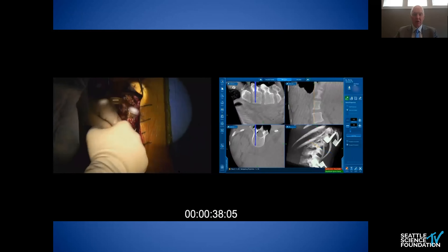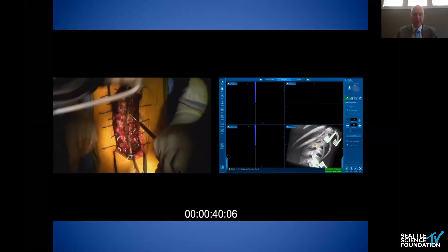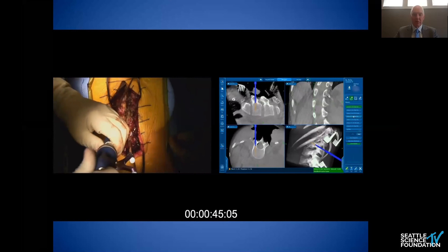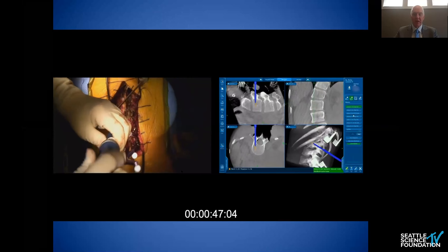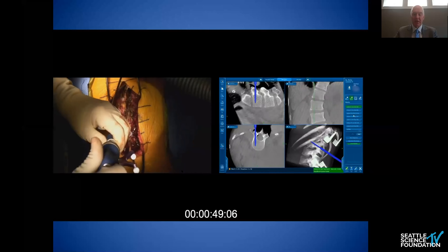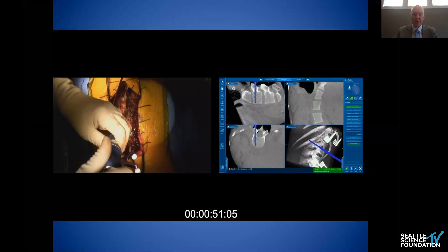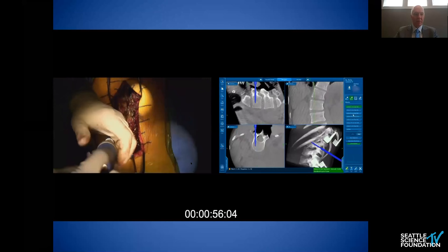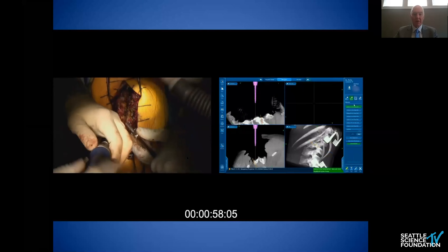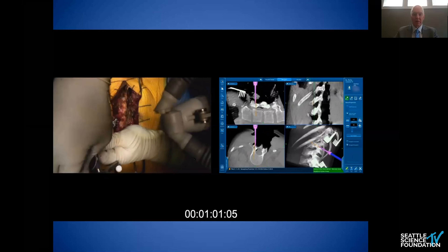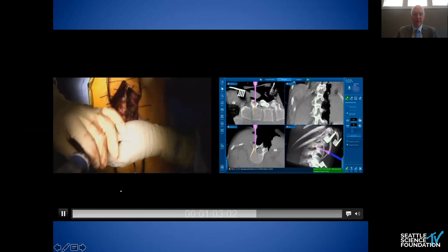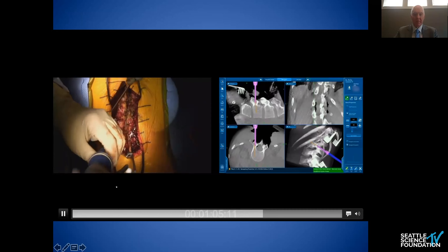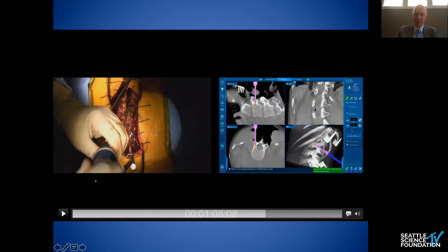As I go to the taps, I'll put the tap in — my partner has it ready to go. As we advance the tap, we'll upsize the CAD file to determine how large a screw it can accept. Since I started using navigation technology, my screws are bigger and longer than before. That's the amount of time it literally takes us to do a screw placement.